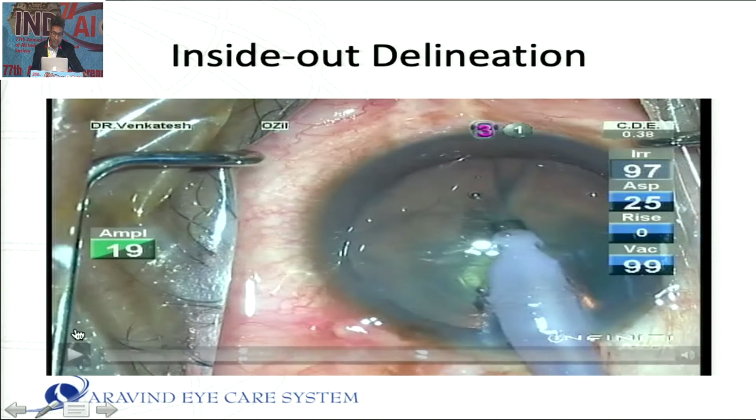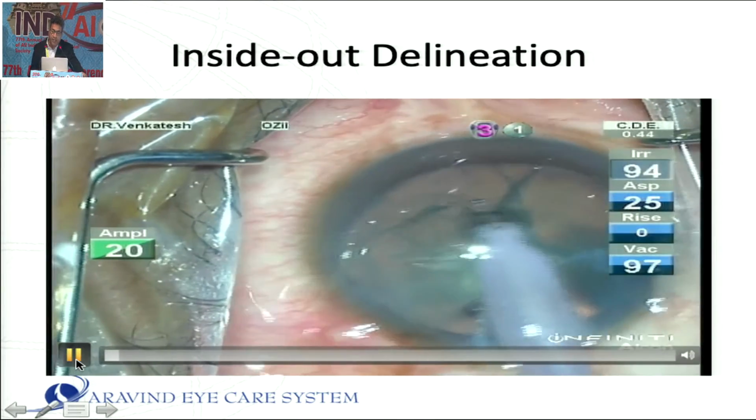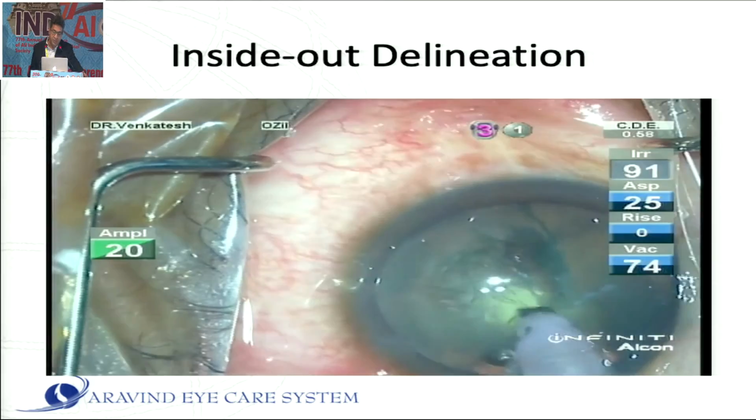So this is one technique, again, recommended by Dr. Abhay Vasavada. He has published this also.